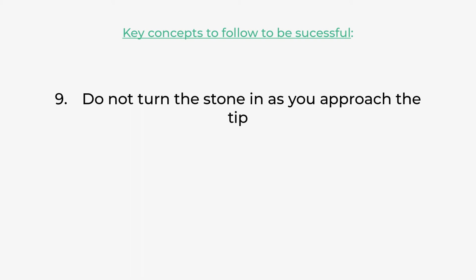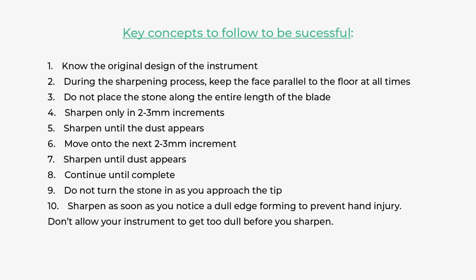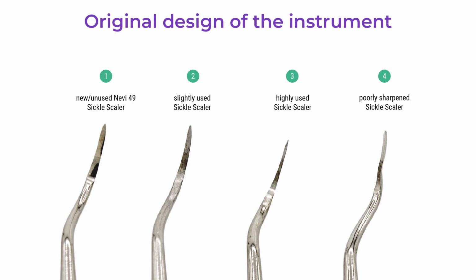9. Do not turn the stone in as you approach the toe, or the tip. 10. Sharpen as soon as you notice a dull edge forming to prevent hand injury. Don't allow your instrument to get too dull before you sharpen. Key concepts to follow to be successful. Let's review each of these key concepts.